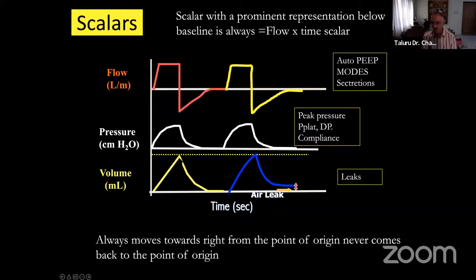This is the tidal volume. So this is the leak volume. So when you talk of volumes, we talk of volumes. So you should not combine. You should always remember that.